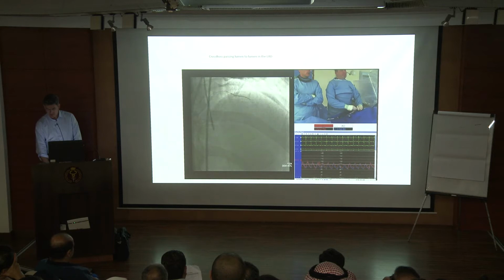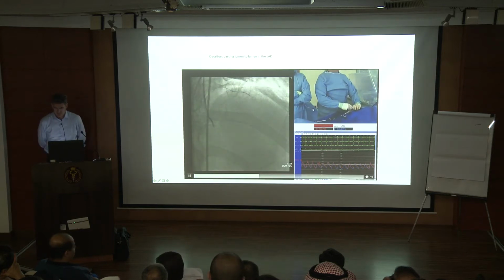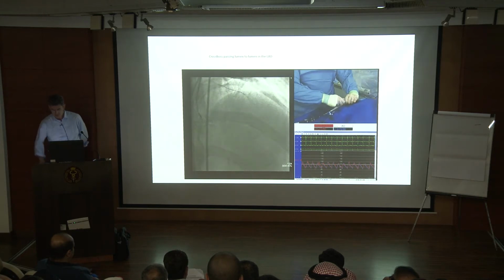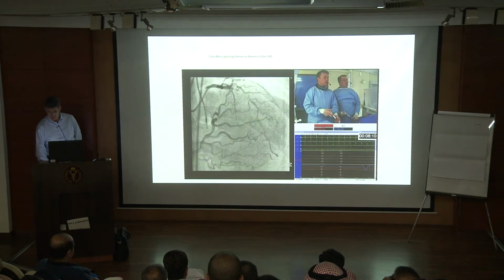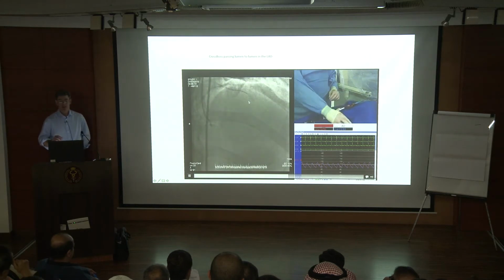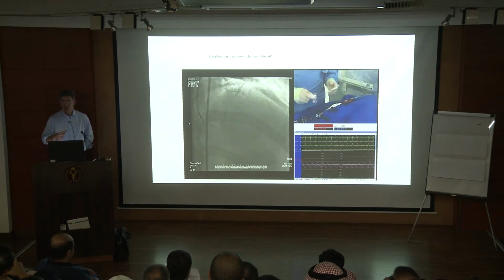Continuing on, you can see his hands spinning away. Let's just play that again. The tip of the crossboss here is spinning very quickly.